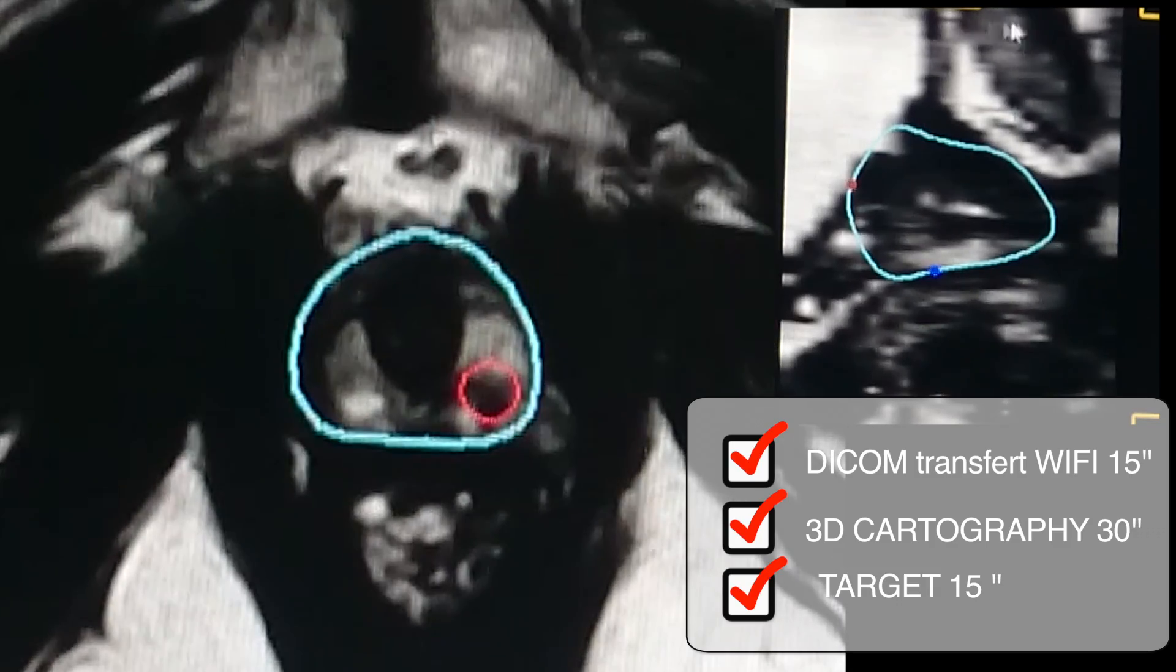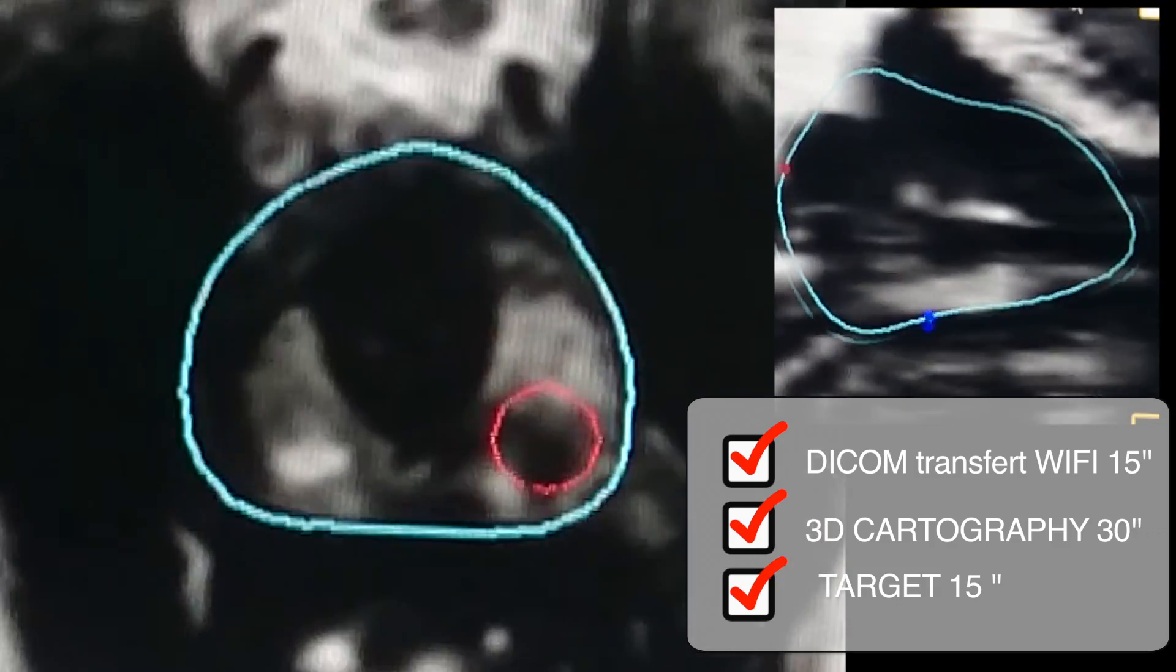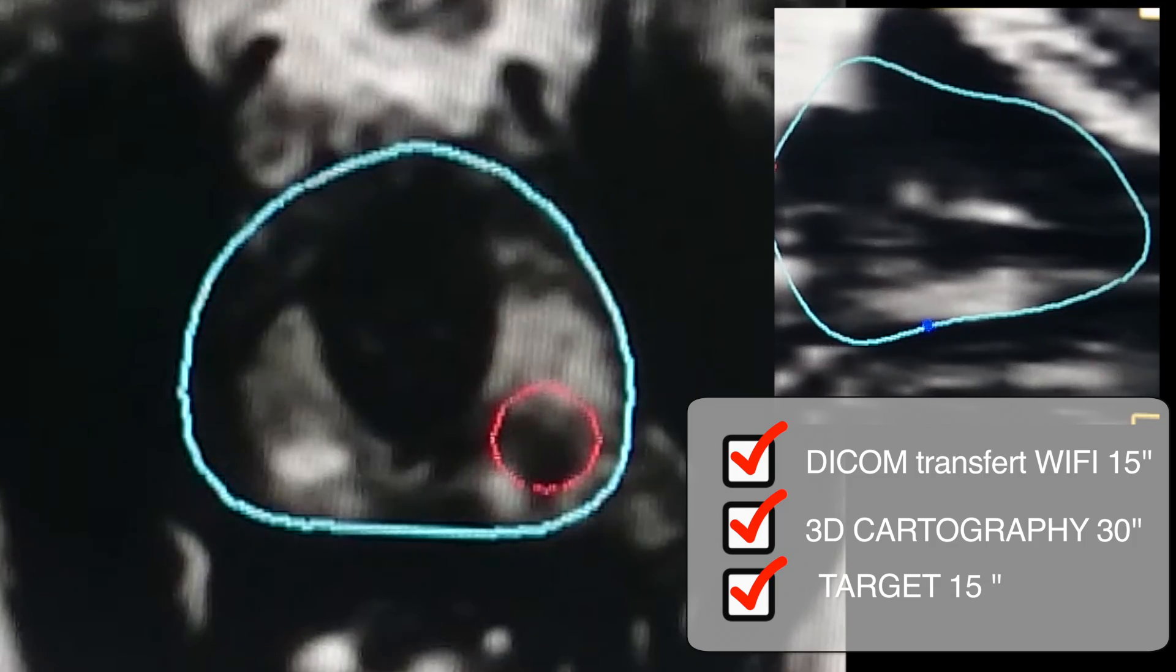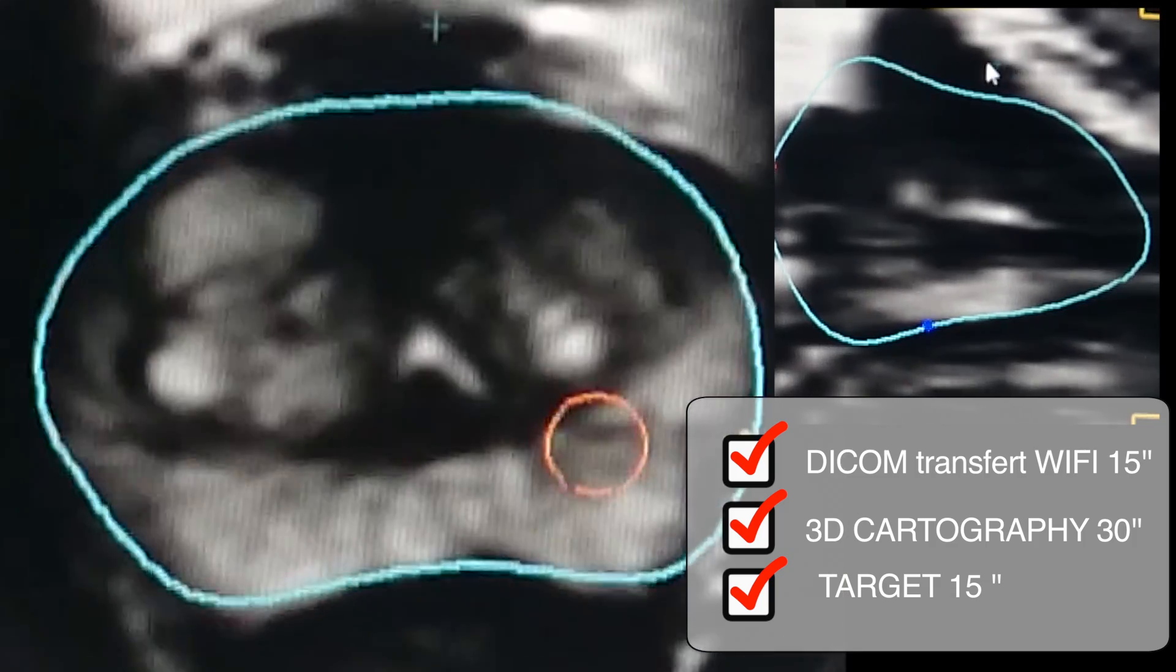Achieving virtual prostate biopsies is possible until finding the good position to target the lesion visible on MRI sequences.